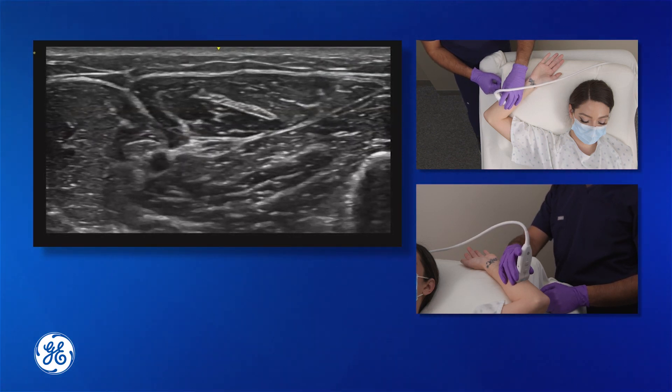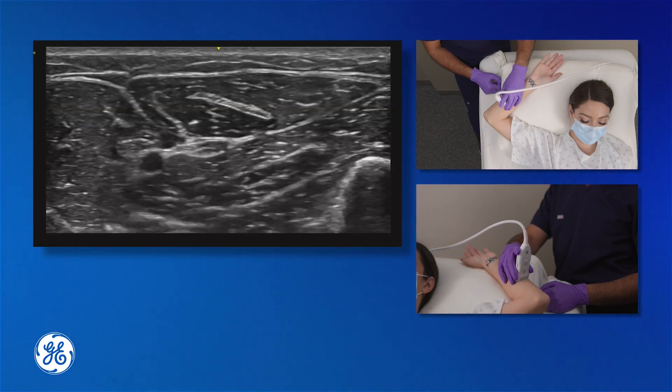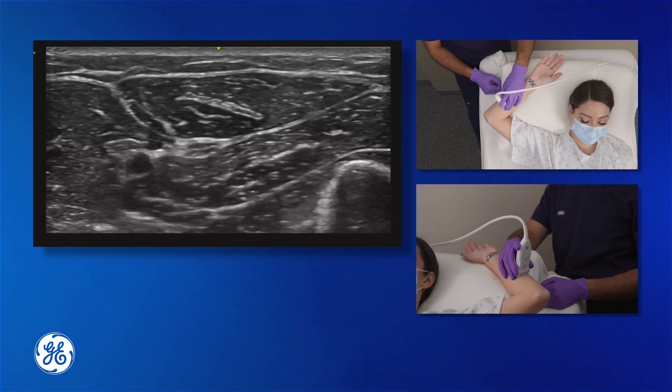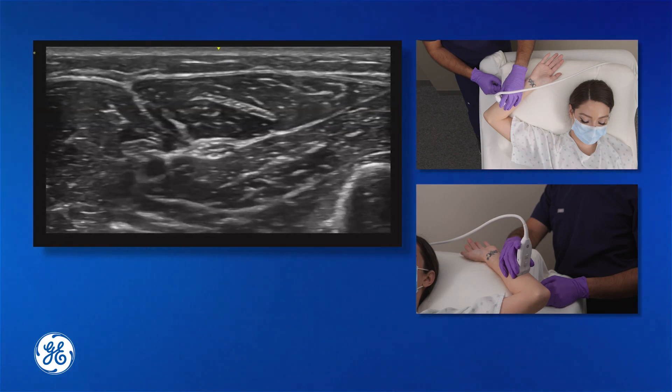The next step is to use a surgical marking pen to mark the spot at which the transducer is, so you can come back easily and find your spot during the block. The next thing to do is sterilize the patient's arm.